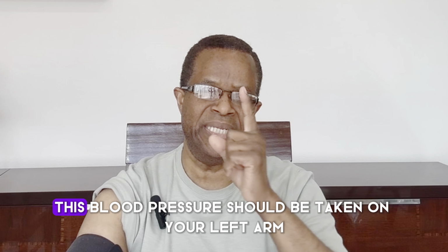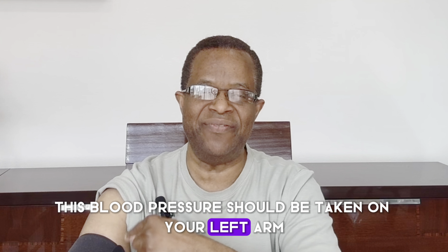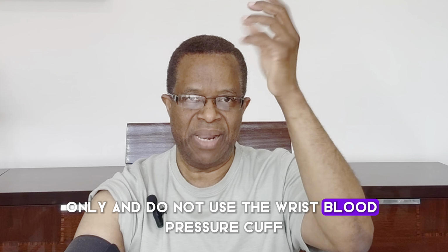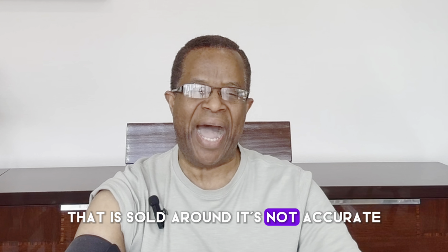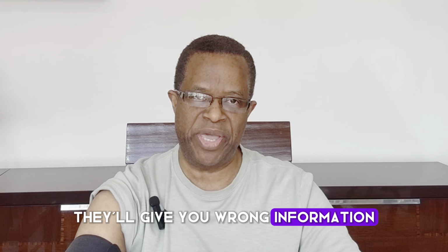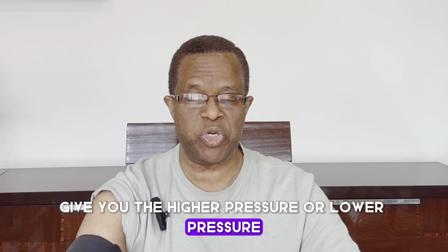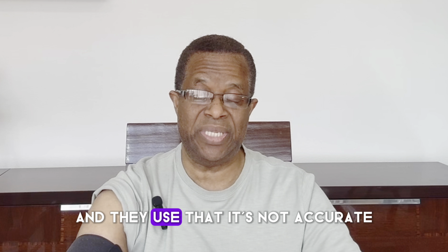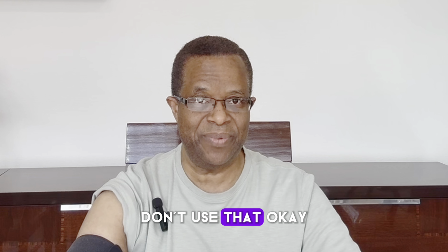Other than that, this blood pressure should be taken on your left arm only. And do not use the wrist blood pressure cuff that is selling around. It's not accurate. They'll give you wrong information, give you the higher pressure or lower pressure. Sometimes you go to the doctor's office and they use that. It's not accurate. Don't use that, okay?